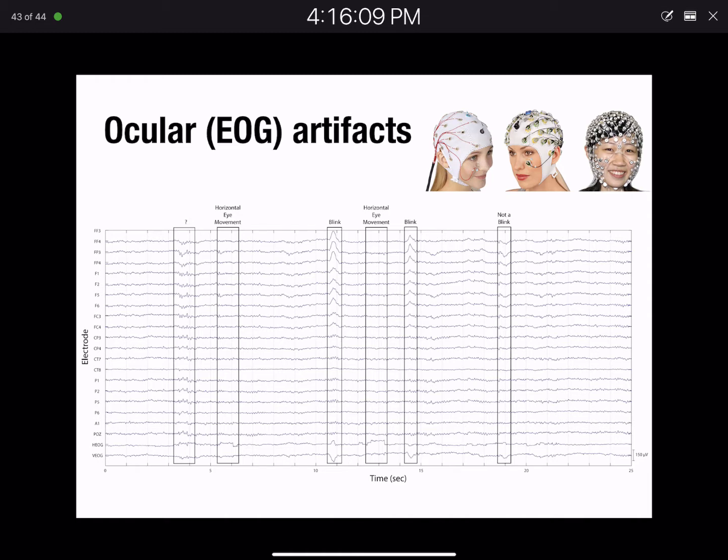Another thing that's sometimes done, especially in visual attention studies where it's really important, say you're looking at peripheral visual attention, so you want somebody to fixate on the center of the screen and you're presenting stimuli out on the sides. And it's important that they're actually processing those stimuli as peripheral stimuli and not just looking at them. And so people monitor eye movements in those experiments. And often what they'll do is they'll actually have an online eye movement detection algorithm running on the computer.